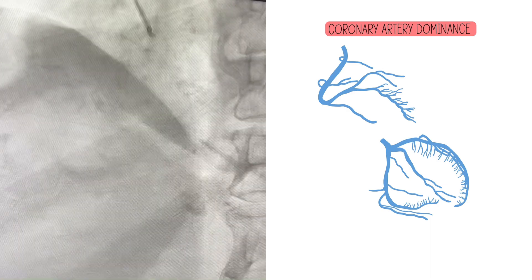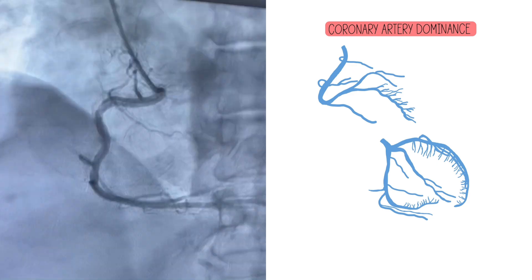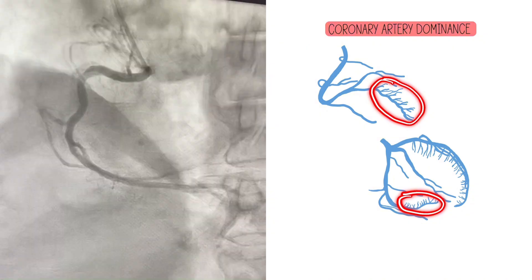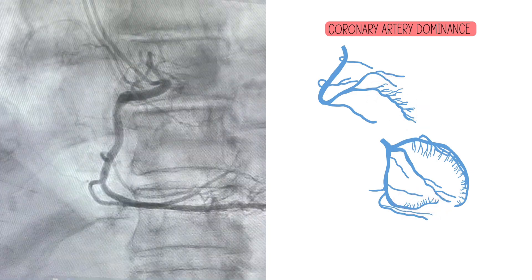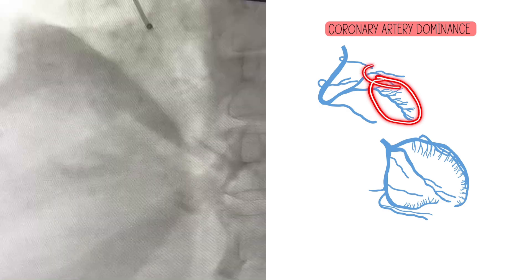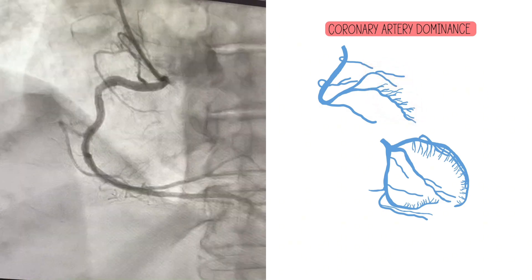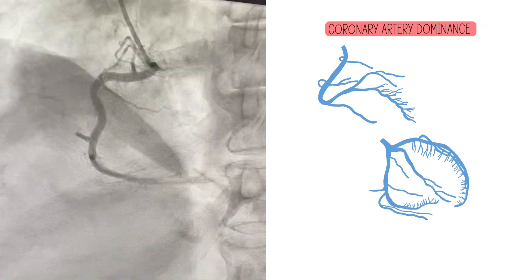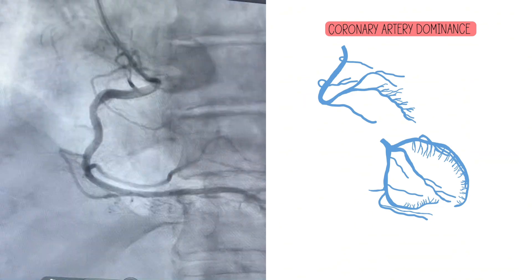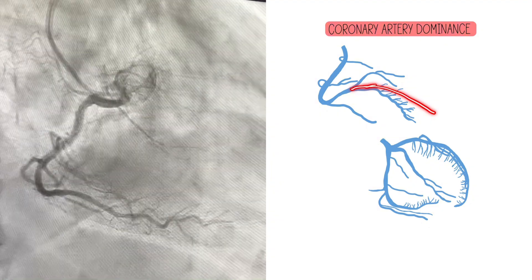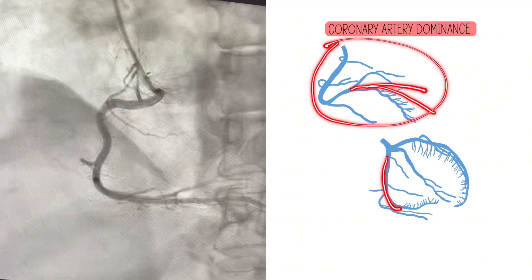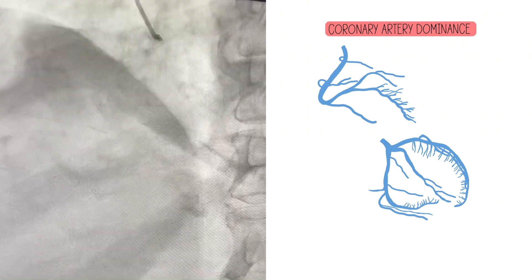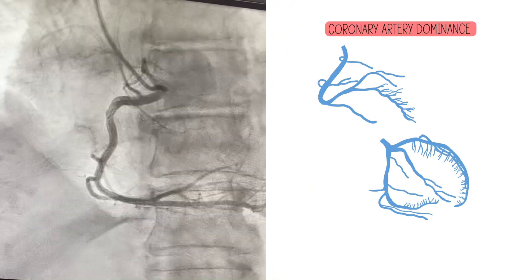Coronary artery dominance is most commonly determined by the location of the PDA — the posterior descending artery — which is the other branch besides the LAD that has septal perforators. But it's actually determined by the location of both the PDA and the posterior lateral branch. Dominance really means how much territory one vessel is covering and how important it is. If both the PL and the PDA are shared between the RCA and the circumflex, those are co-dominant vessels.